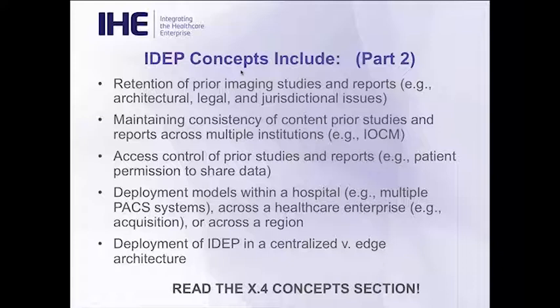So if we pull a study locally, but it changes on the remote archive or the originating site, we discuss how to at least illustrate what the issues are and talk about how IOCM could potentially help solve those issues. We discuss the access control for prior studies and reports and the fact that there potentially has to be patient permission to share that data in advance, again, depending on legal and jurisdictional issues.